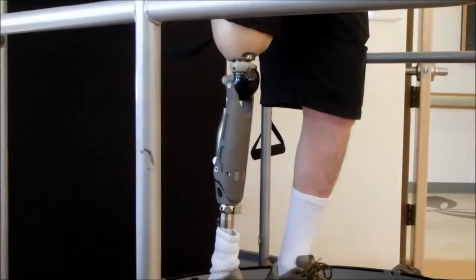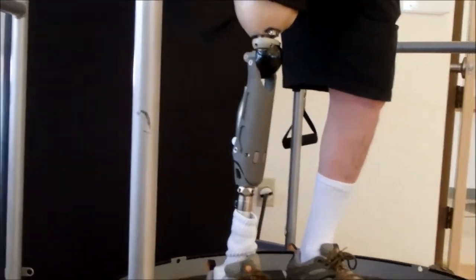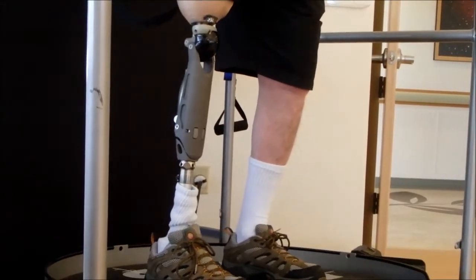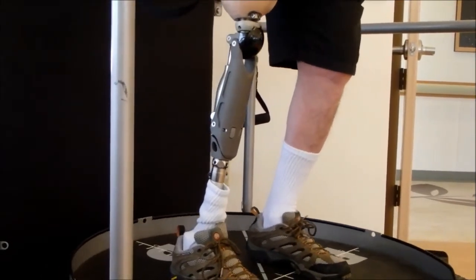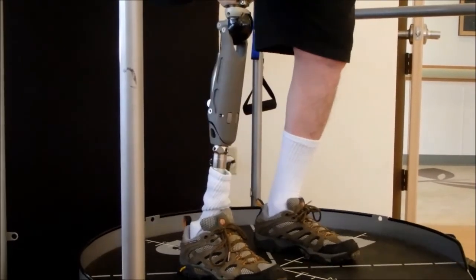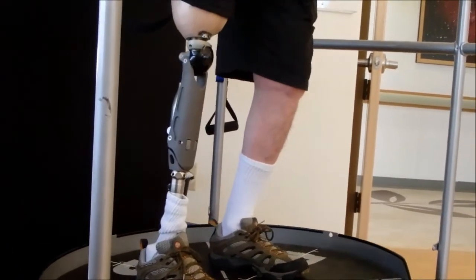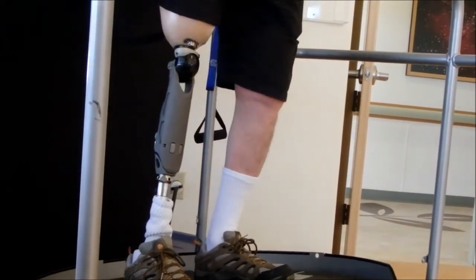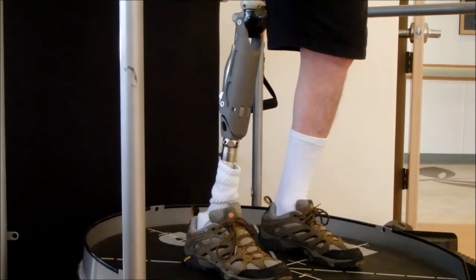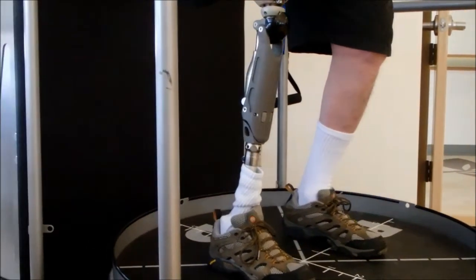Now, this particular video you're looking at right now is of a gentleman that is wearing this knee for the very first time. His leg is aligned for an electronic knee, so in essence, the VGK is in an unstable alignment. Now notice when he's balancing that he goes into a stance flexion mode to control the angle in his balance. What he didn't realize is he was actually doing that. He felt when the knee went into extension, then he knew that something happened, but he didn't know that he was doing a normal flexion of the knee to control the unevenness of the floor.